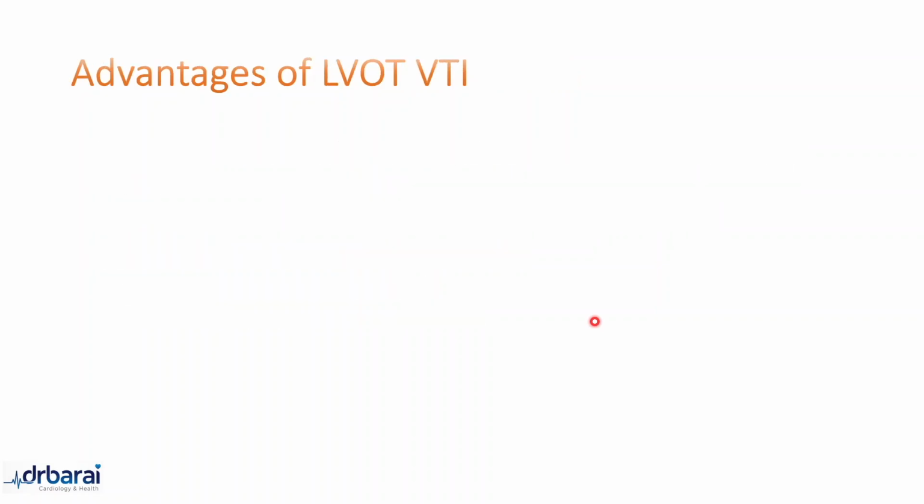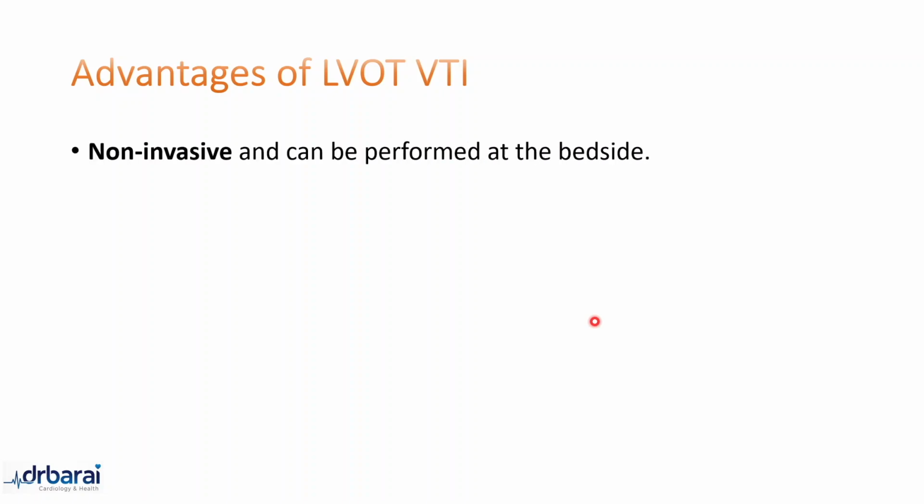Now, what are the advantages of LVOT VTI? I hope that you have understood what I have told you so far. If you have any questions, please drop me a line in the comment section. The main advantage of the LVOT VTI is that it is non-invasive and it can be performed at the bedside. It is portable. It provides real-time hemodynamic data.